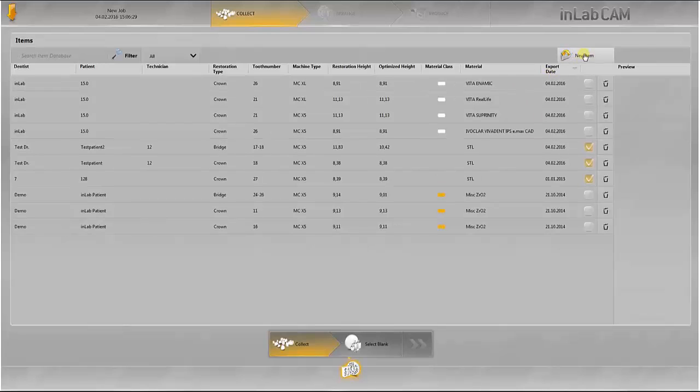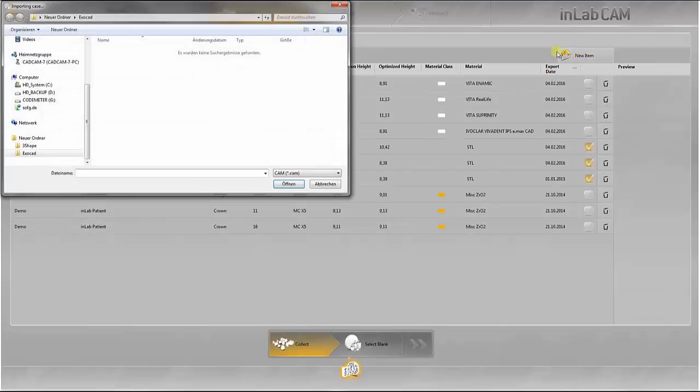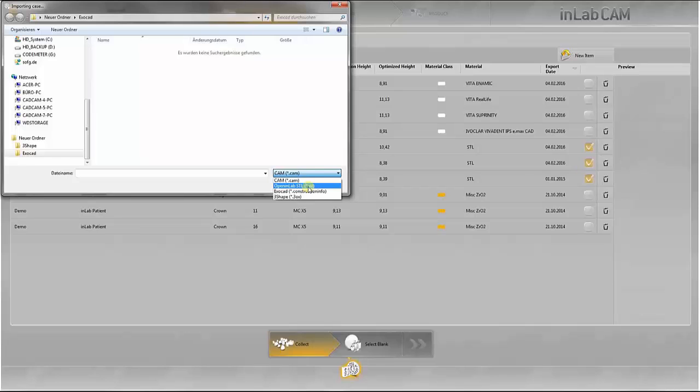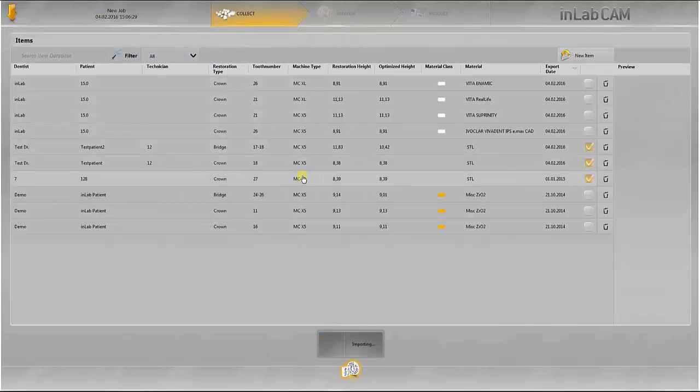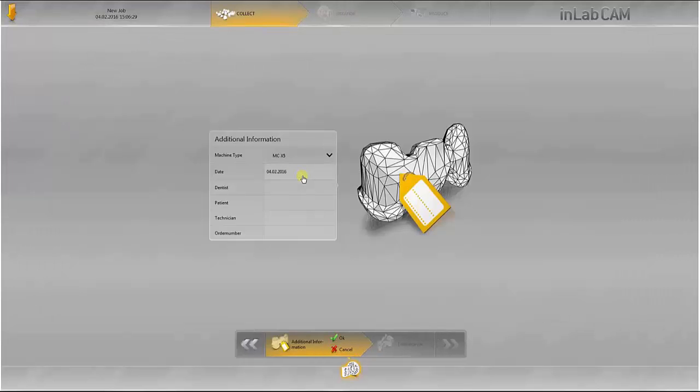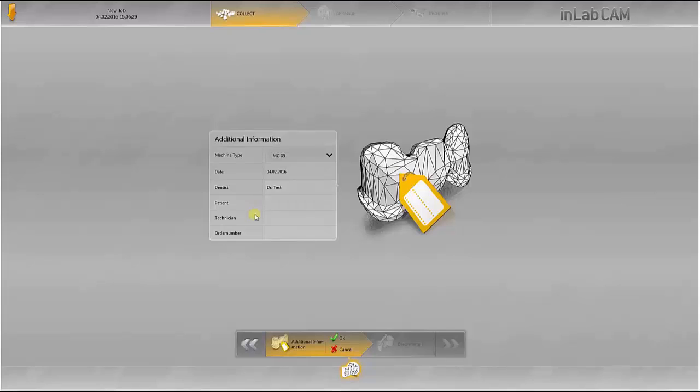A bridge in STL format is imported as the third restoration. Here again, all the information required for assignment of the design must be entered and the margin lines marked.